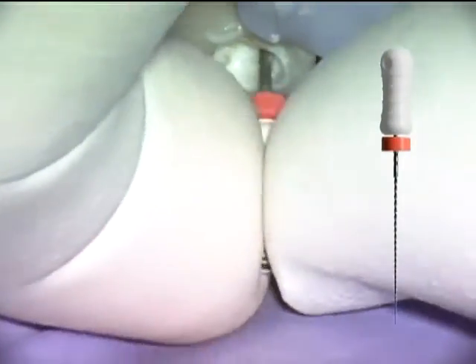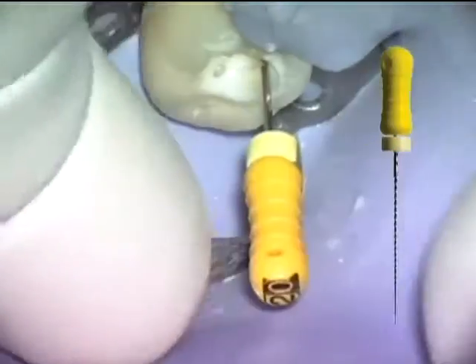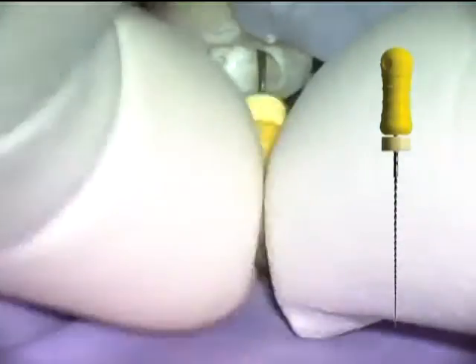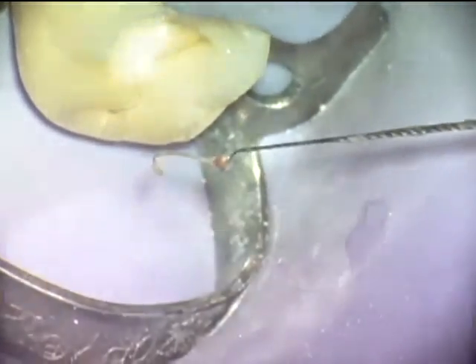If the number 15K file resists placement to length, lightly using a number 20K file with a balanced force technique will create enough shape for the number 15 to easily fit to length. This is the pre-shaping requirement prior to rotary shaping with GTX files. Note the pulp tissue removed with one of the negotiating files.